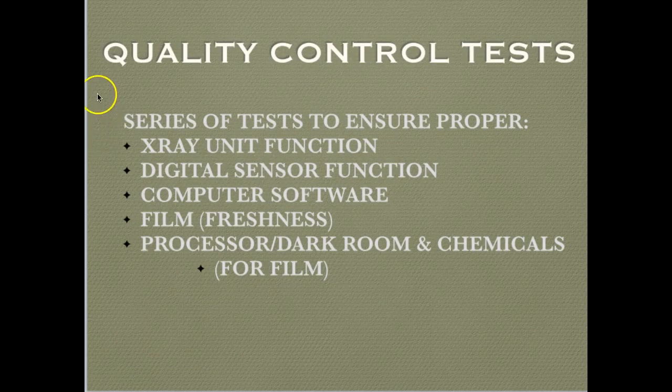Also, having quality control tests will ensure diagnostic quality images. So there are a series of tests that you can perform for your x-ray unit function, for your digital sensor function and your computer software. If you're still using film, you want to make sure that your film is fresh, it's not expired, and of course you need a processor of some sort, whether it is an automatic processor, or if you're still using a dip tank, you want to make sure that the darkroom is in good condition and the chemicals that you would use for film processing.